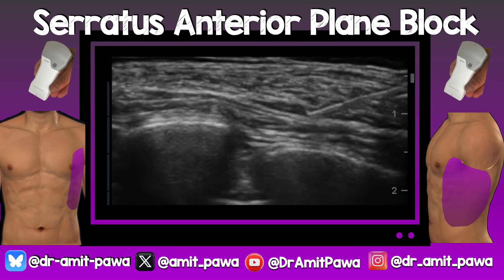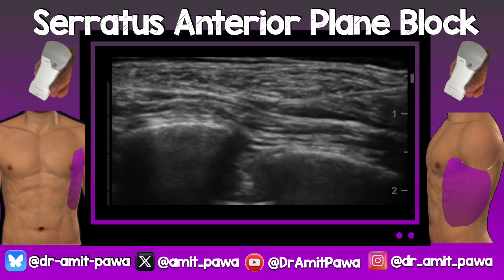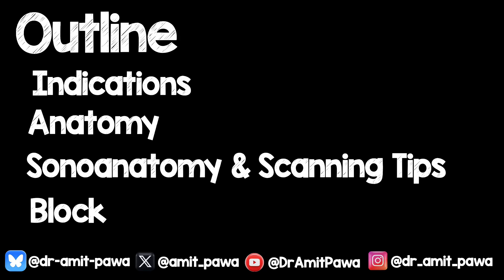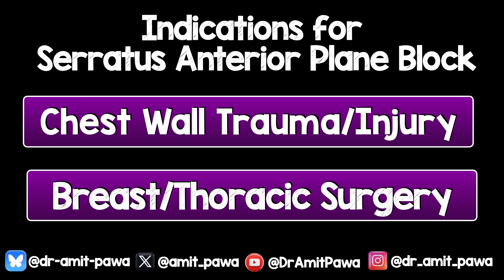In this video, we will cover the ultrasound-guided approach to the serratus anterior plane block. I'm going to cover the indications, the anatomy, the sonoanatomy and tips, and then show you some blocks. The indications for the serratus anterior plane block are chest wall trauma or injury, and elective breast or thoracic surgery.